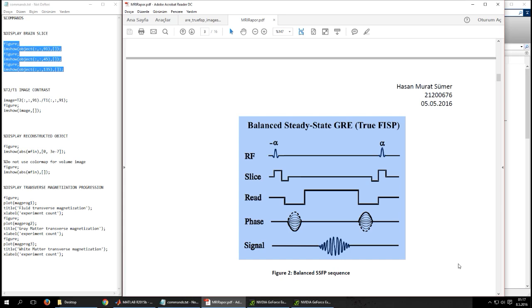Another method to achieve steady state is to use inversion recovery methods. Applying an inverting pulse and waiting for inversion time Ti before applying the alpha over 2 pulse may help achieving steady state quickly. But for three different tissues, a single inversion pulse will not be enough. Also, if a single inversion pulse is applied, the reconstructed image's contrast will be affected by the value of Ti.